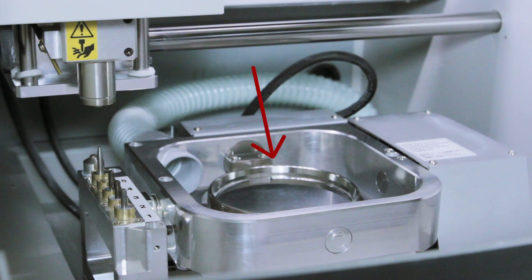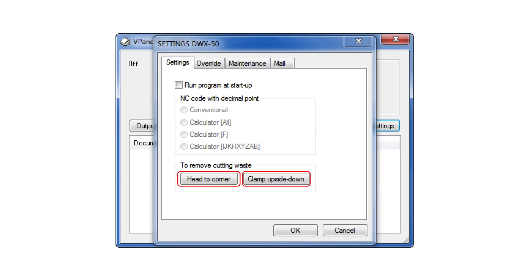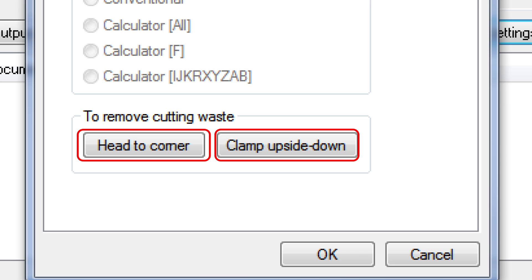Pay special attention to the clamp, automatic tool changer, and spindle. Using your v-panel, you can flip the clamp over by clicking on clamp upside down, and also move the entire rotary to all four corners by clicking head to corner.